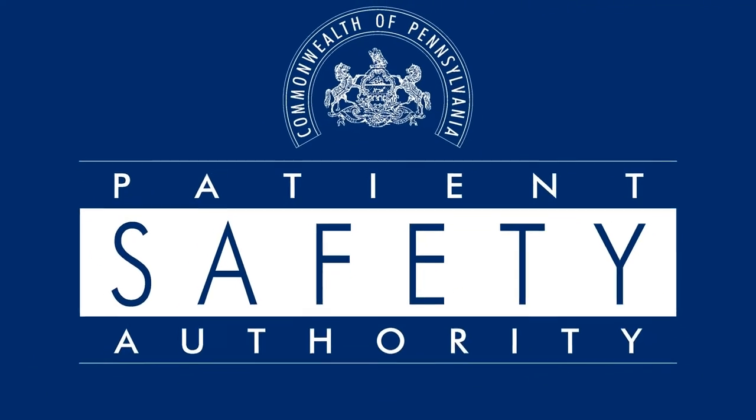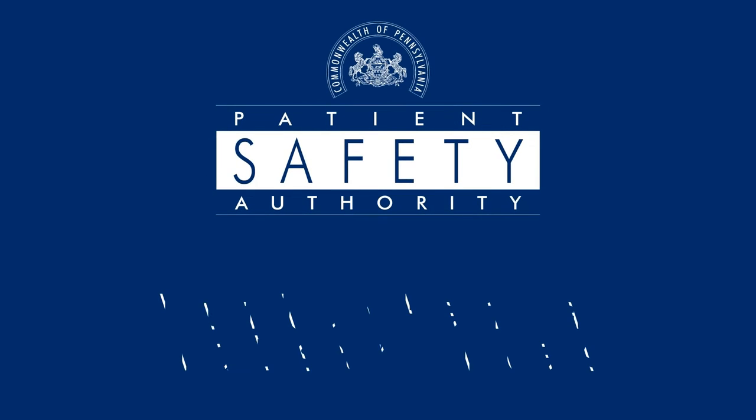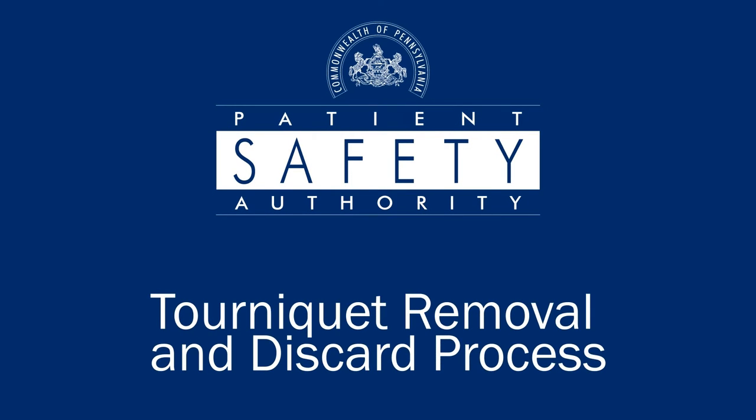Sometimes tourniquets are accidentally left on patients' extremities after a procedure or test is performed. Whether you are performing a phlebotomy or starting an IV, this video will show you tips to avoid leaving the tourniquet in place by mistake.